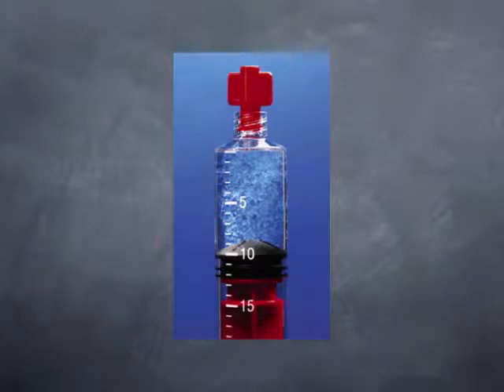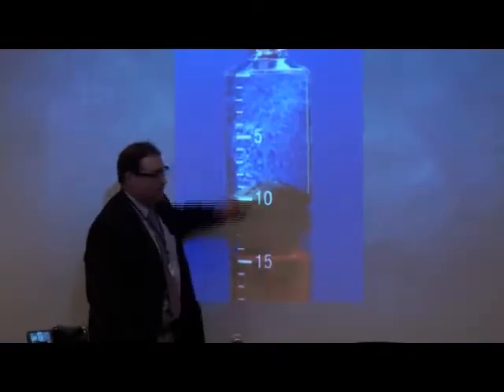When you mix the particles, which are the white, it looks like a snow globe. But basically all the white stuff in here is mixed with X-ray dye contrast that we inject using those real-time X-rays into the catheter, into the blood vessel that's feeding the tumor. And just that alone, without chemotherapy, will block up the blood vessel and the blood supply to the different tumors.